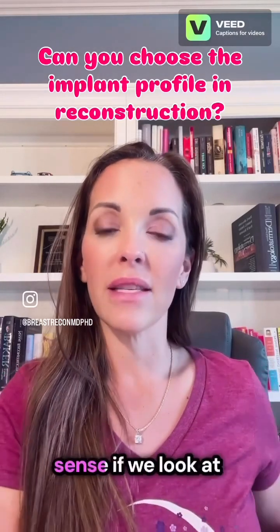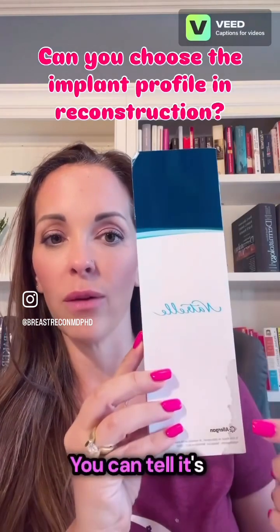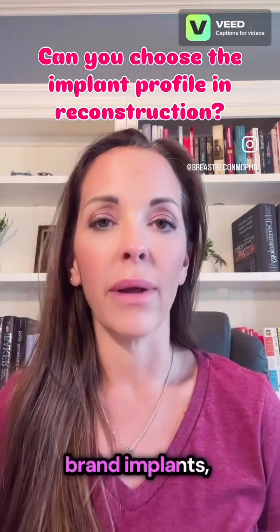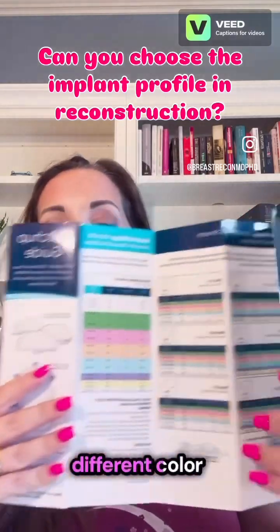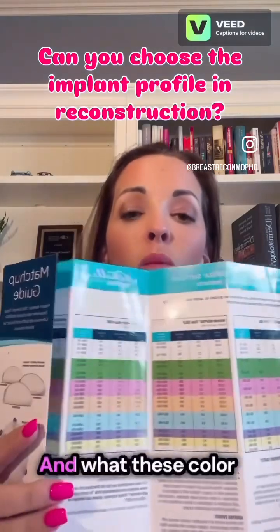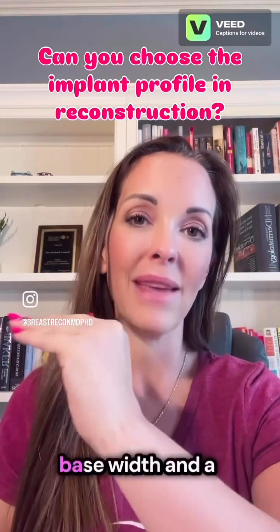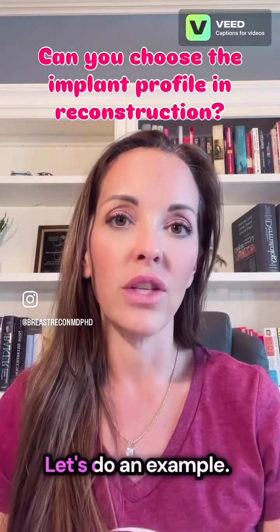This might make sense if we look at my handy Allergan implant guide. You can tell it's well loved because there's coffee stains on it. Now I use Allergan brand implants, but it's the same theme with any implant. And you can see there's all these different color-coded tables. And what these color-coded tables tell you is for a given base width and a given volume, what the projection would be. Let's do an example.